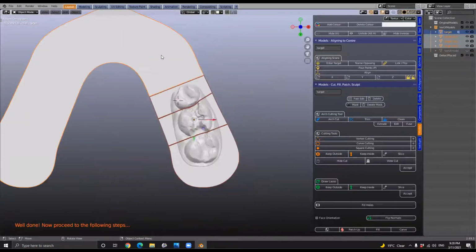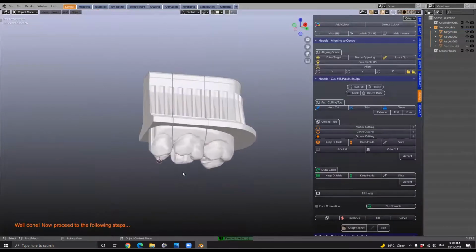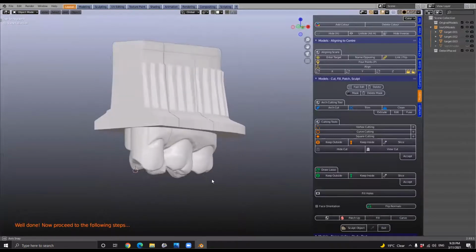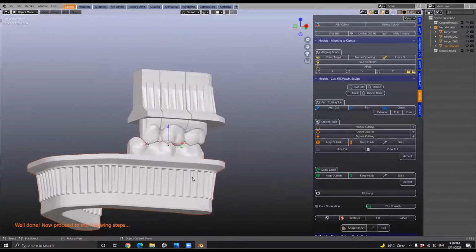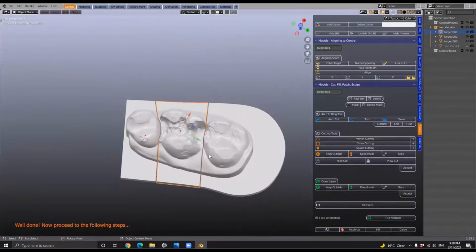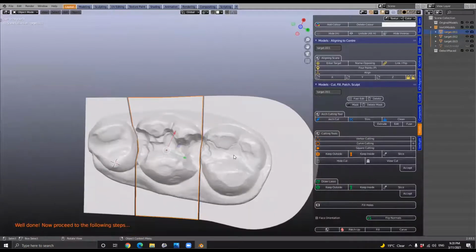Okay, that's excellent. So this one we're going to delete, and we've ended up with dies like that we can insert then. And we would then do the same thing with the lower. And then from there, we can do our crowns or bridges. I wanted to show you this one because I made that zigzag going across there.